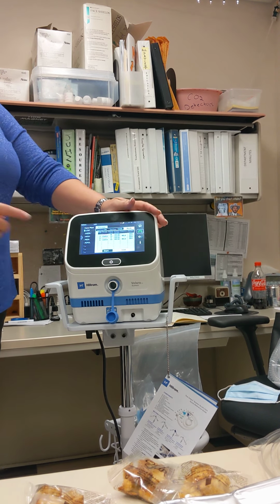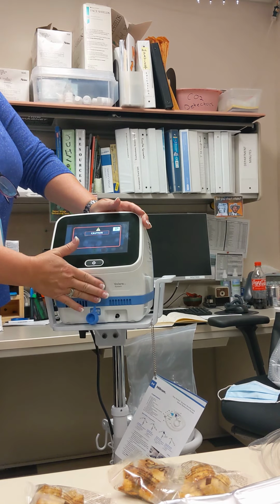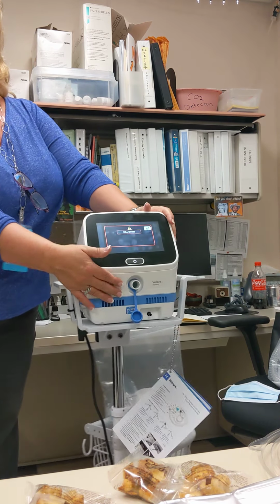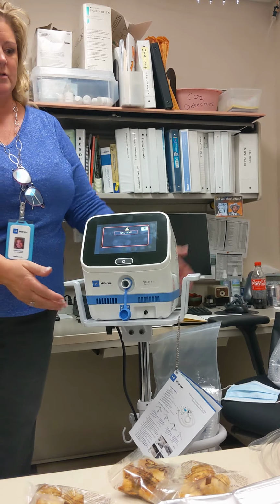They go in and pick a room number, hit start, and they'll see the error. And that's another thing: you have to have your circuit plugged in. Otherwise, you're gonna get a biofeedback error. Then you gotta grab a circuit and plug it in.